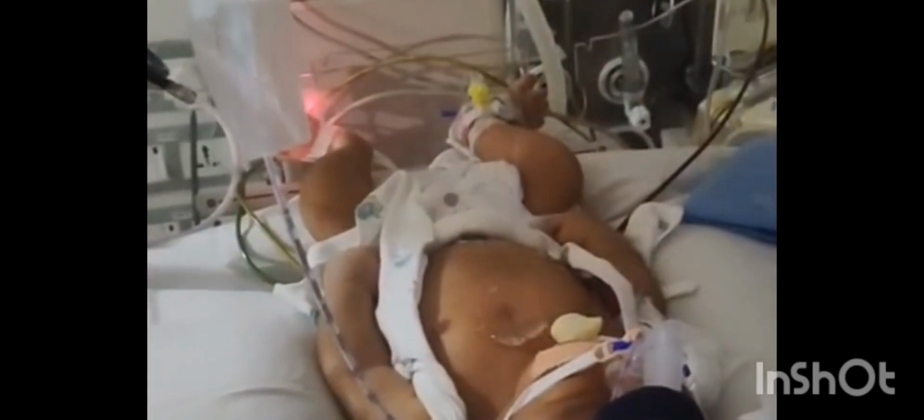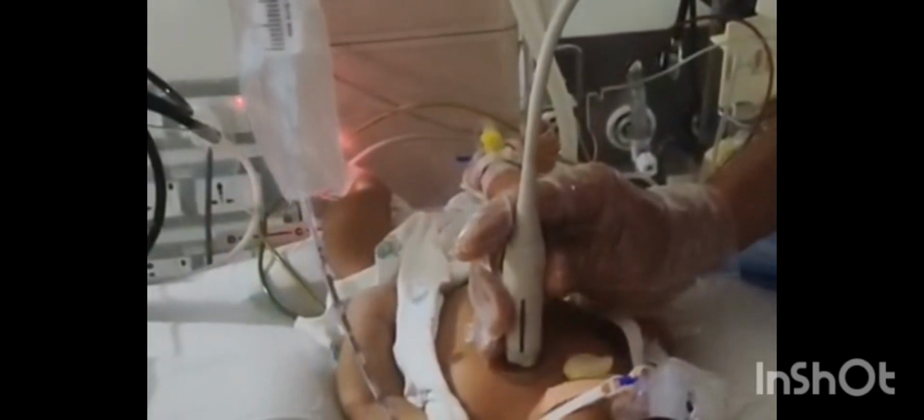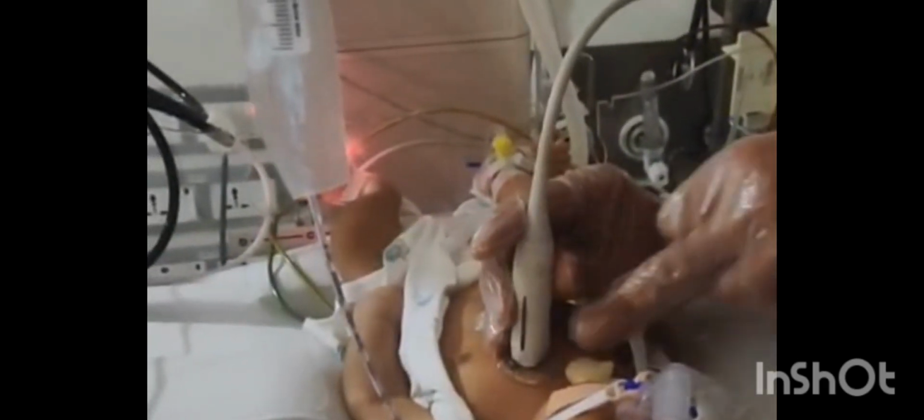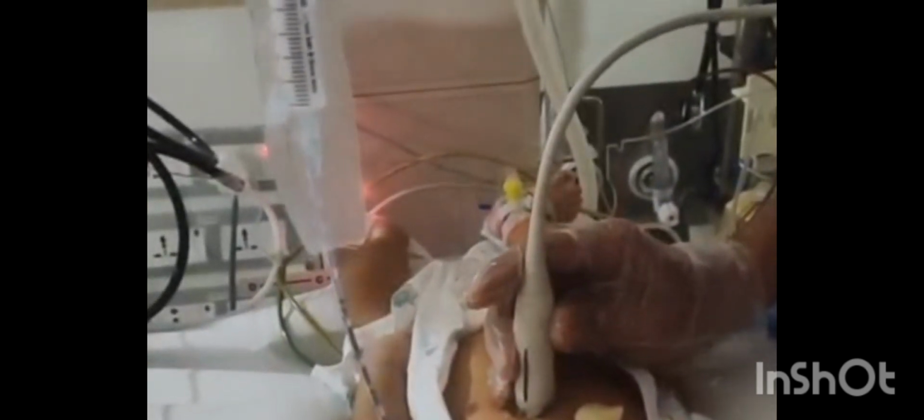You have to take the parasternal short axis view. For that, you keep your probe in the second or third intercostal space, with the marker facing the left shoulder joint. Are you okay with that? Yes. Now you can see the image. The image shows the root of the aorta. This is a parasternal short axis view of the heart, where in the center you are seeing the root of the aorta. This is exactly what you have to see. What view? It is a parasternal short axis view.